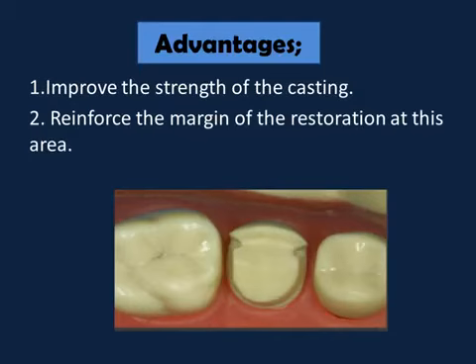So the advantage of the occlusal offset will be improvement of the cast strength. Besides, it will reinforce the margin of the restoration at this area.